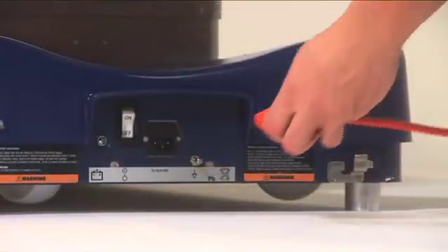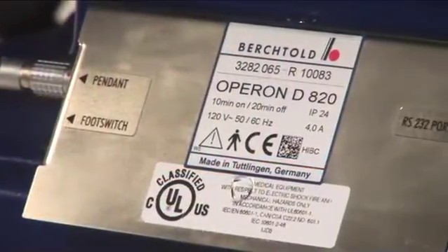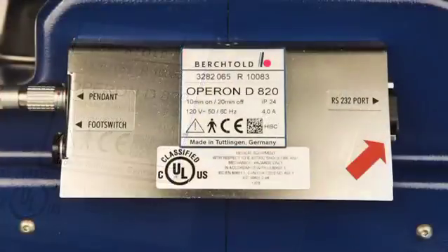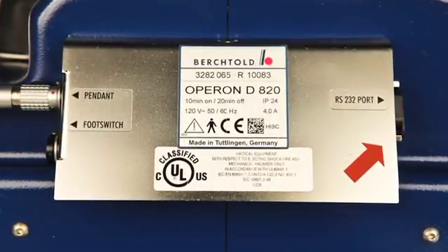The main power switch, power cord plug, and grounding post are found at the base of the table. The RS232 port can be found to the right of the hand pendant port. The RS232 connection allows biomedical staff to electronically diagnose issues using the D820's troubleshooting software.